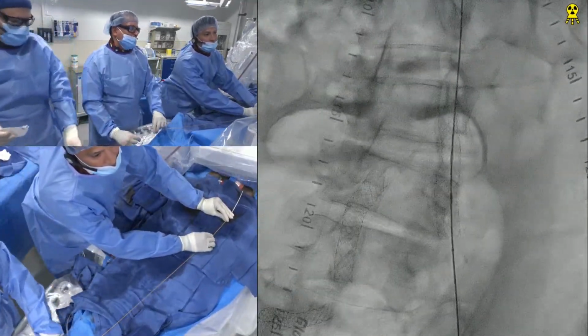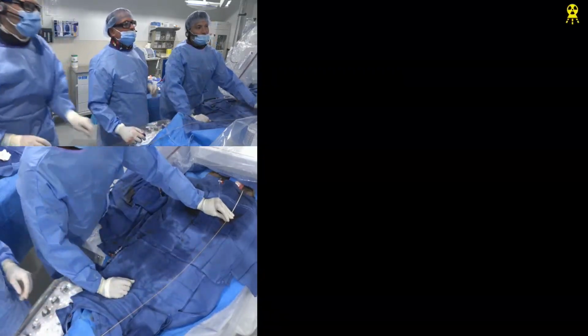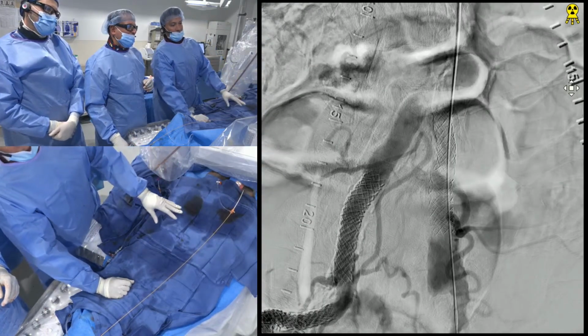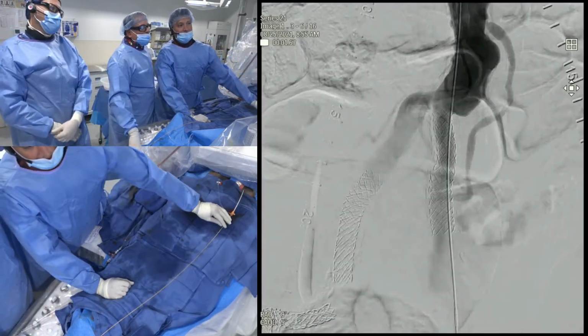Hold on, let me walk it out. Do you want to take a picture? Yeah, of course. Much better. See, now you're kind of opposed, but you're not really opposed. I would probably still take it into the vessel and then go up nominal more.